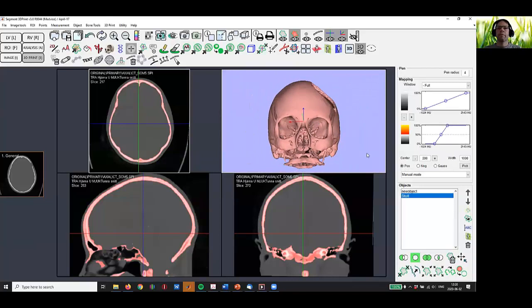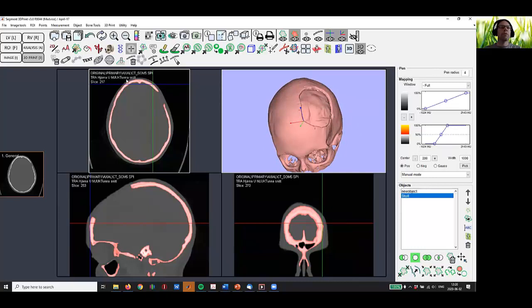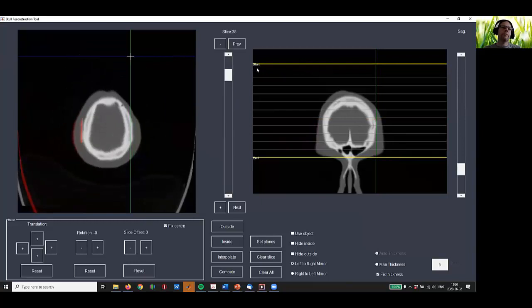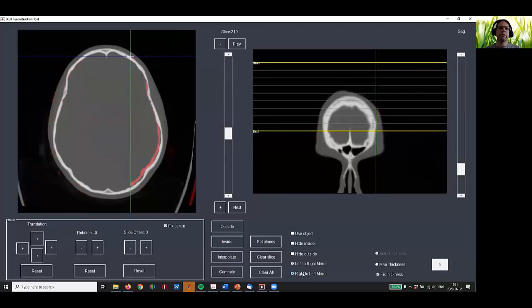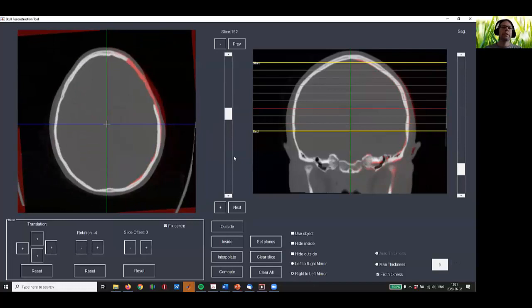See here the case, a quite big hole from previous surgery. So we'll now make a mold of this. What we will do is start our tool for that. The first thing is we determine where to start. Here the deformity starts, so it's over that. I go down to see it. Make some even set planes. This is going to be a right to left mirror, so we'll mirror the right side to the left side. Put the approximate center marker, rotate a bit, translate it, and you can see, it seems like a good mirror position.